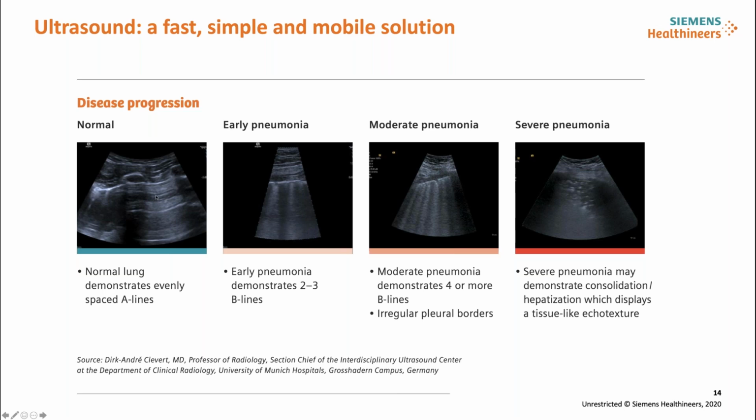The first one doesn't look like anything special, but if you recognize a certain type of lines like this, the doctors will know that there's nothing to worry about. Yeah, normal lung. If they start to see some specific lines, like vertical lines, that's usually a bad sign, because it means that actually the ultrasound can go inside the lung.